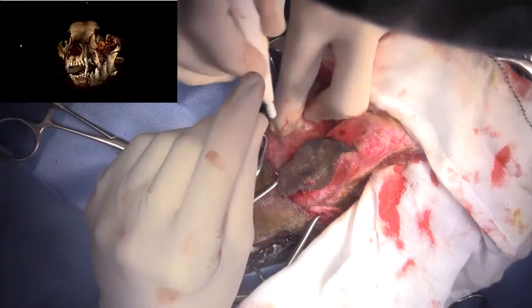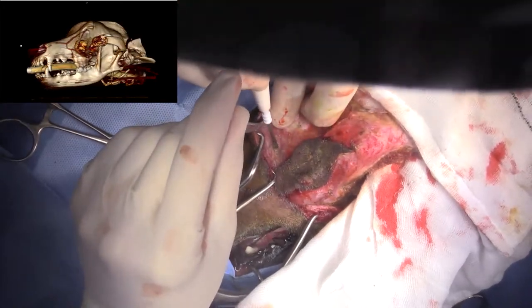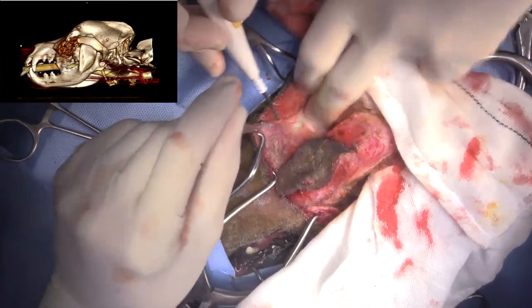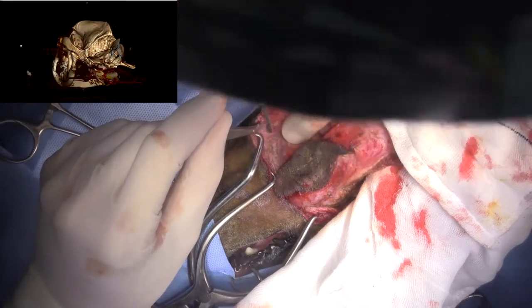Will the eye drop a bit after the arch is removed? Yes, but not perceptibly. You might see a little bit of a drop, and if it was a human, you might have double vision or something. But obviously, that's not something that we need to worry about too much with dogs.